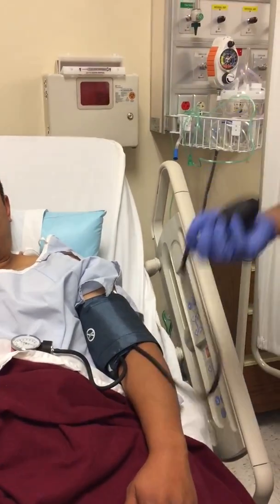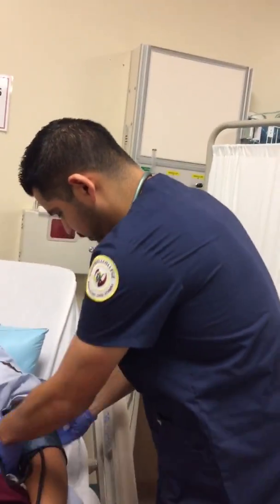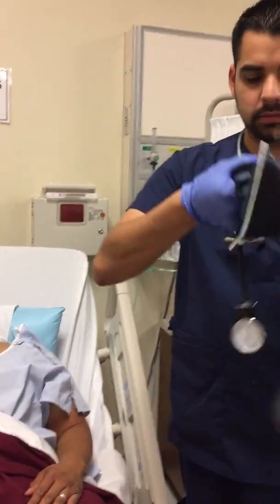Okay. 124 over 88 is what I got. Thank you, Richard. Put this back.